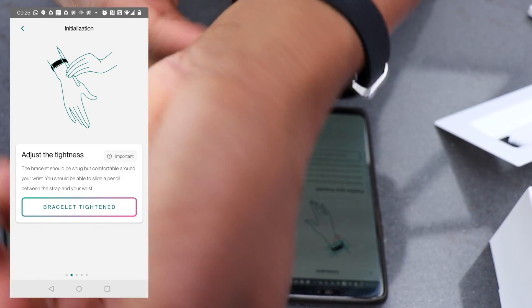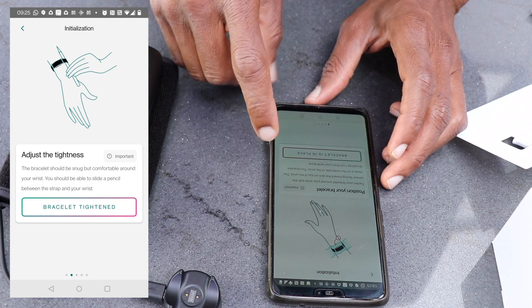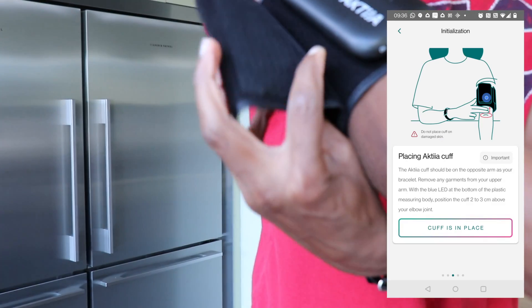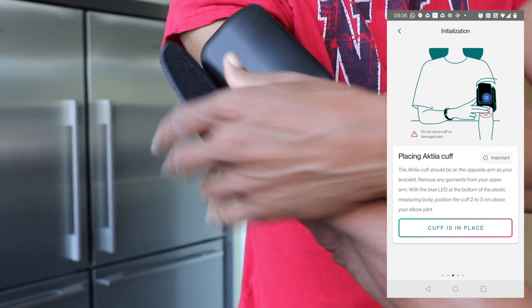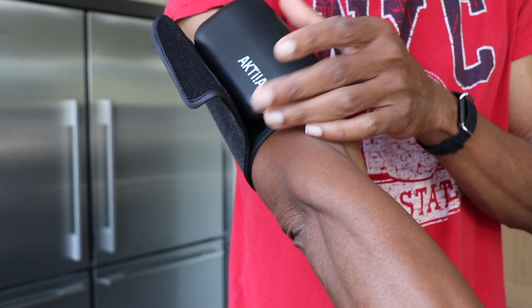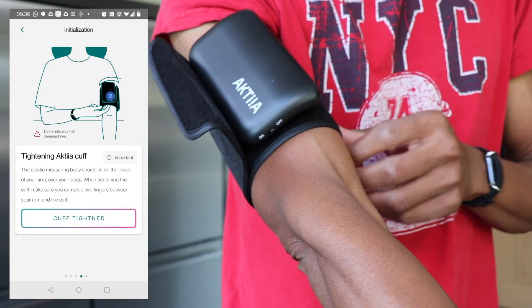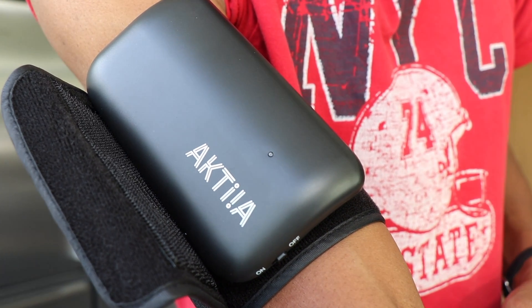Put the cuff on the opposite arm to your wristband. So if the wristband is on the left, the cuff will be on the right, and if the wristband is on the right, the cuff will be on the left. Make sure the cuff has a snug fit around your arm.